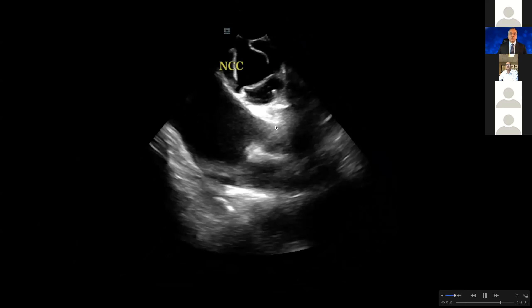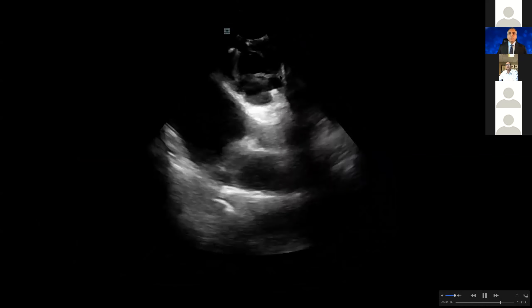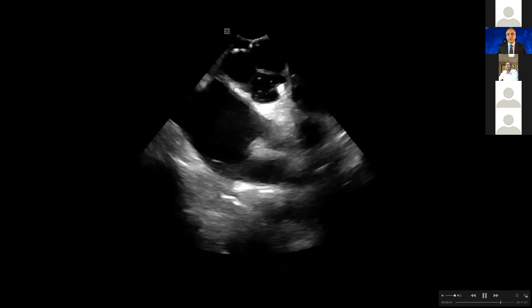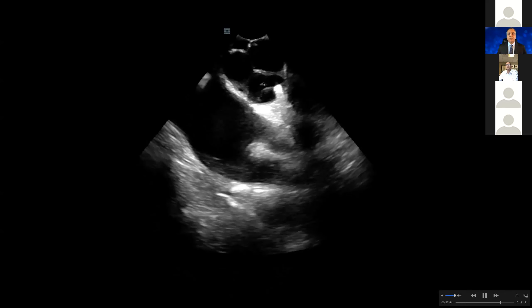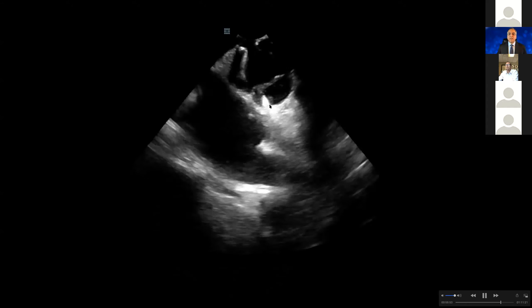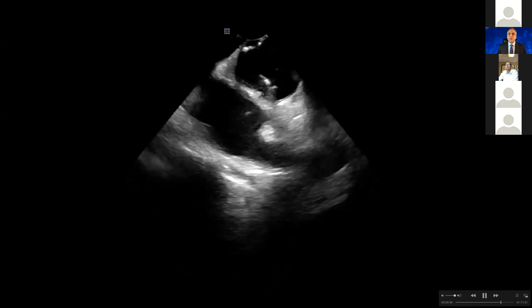So here you can see a short axis view — non-coronary cusp. Why is it the non-coronary cusp? Because the septum is here. You don't need to memorize it. Why is this the left coronary cusp? Because the left atrial appendage and left atrium are here. So the remaining one is going to be the right coronary cusp. With a little more clockwise rotation, I see the non-coronary cusp and the right coronary cusp. My ablation catheter was in the left coronary cusp. And here you can see the ablation at the junction of the left and the right coronary cusp, and then at the junction of the left and non-coronary cusp.